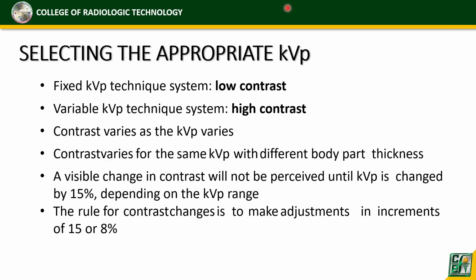Nag-increase tayo eh. Anong mangyayari? Kapag increase ng 15%, so, i-decrease po yung MAS by half po. Very good, by half. Pag naman nag-decrease tayo ng 15%, saka tayo magdo-double ng MAS. Tama ba? Opo. Okay. So, may question pa?